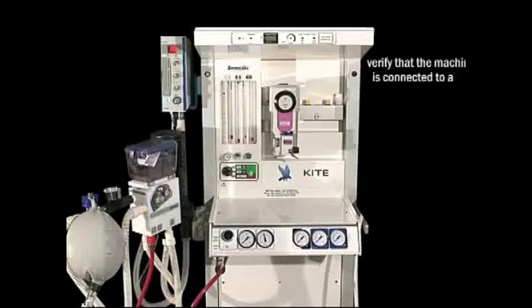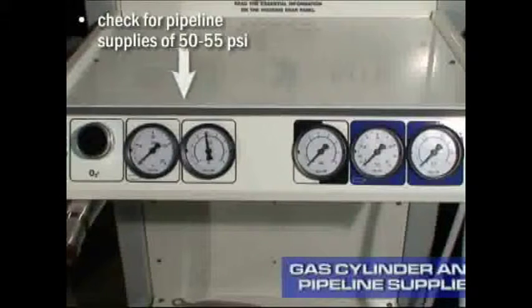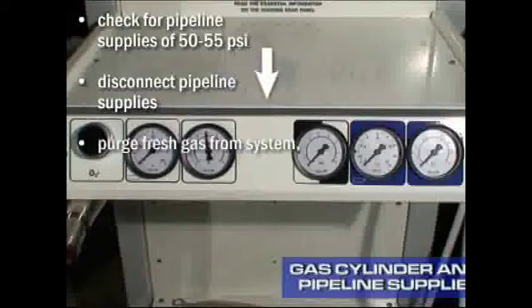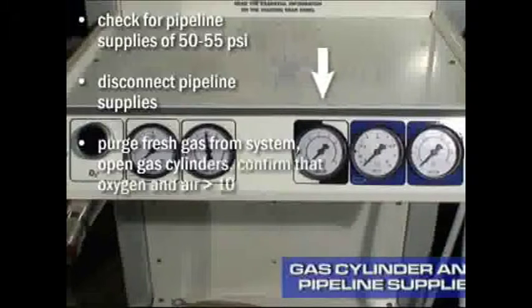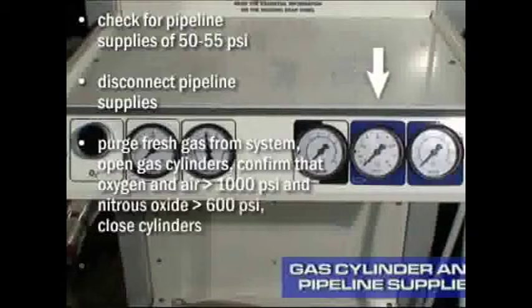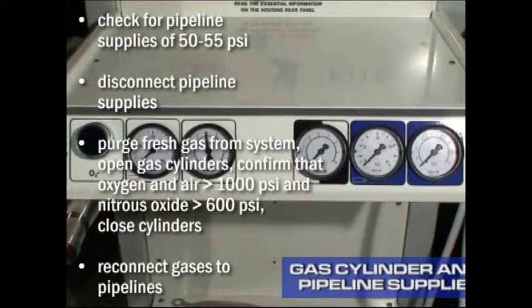Verify that the machine is connected to a live, grounded outlet. Check for pipeline supplies of 50 to 55 pounds per square inch. Disconnect pipeline supplies. Purge fresh gas from system. Open gas cylinders. Confirm that oxygen and air are greater than 1,000 pounds per square inch and nitrous oxide greater than 600 pounds per square inch. Close cylinders. Confirm no prominent decrease in gas pressure. Reconnect gases to pipelines.